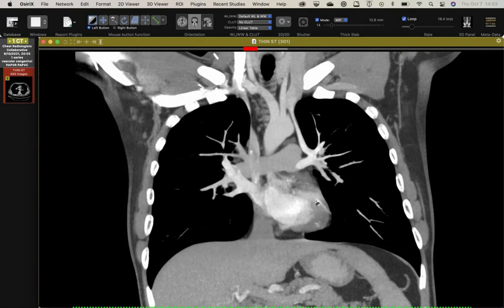And sure enough, I looked it up and that's exactly what it was. Okay. Levoatrial cardinal vein. I will rename the case. But yeah, that's just a pretty example that happened to have nice contrast. Yeah. So I guess I literally showed one six weeks ago.